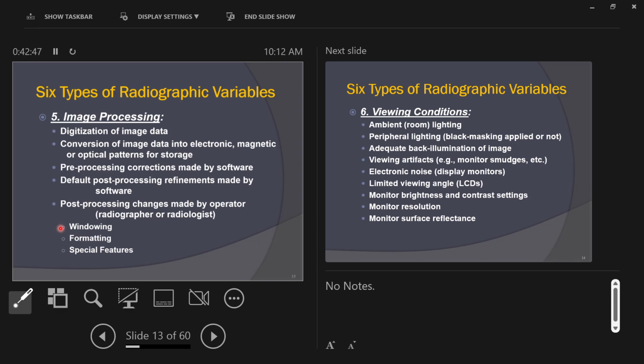Windowing is basically brightness and contrast changes. I get the impression that the doctors don't fiddle with that much. Some don't, some do. Some prefer that you don't touch it at all. Some prefer that you do it well, so they don't have to. It depends. In a perfect world, the physicians don't have to do anything to the image. They bring it up, they go, yep, there's the thing, and then they move on. They don't want to have to do stuff to the image.